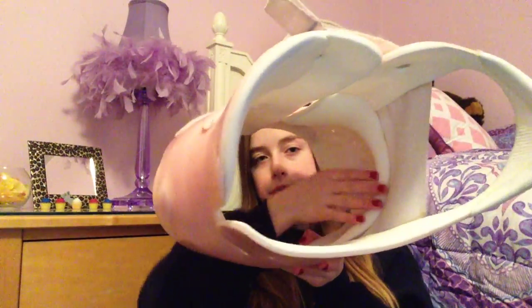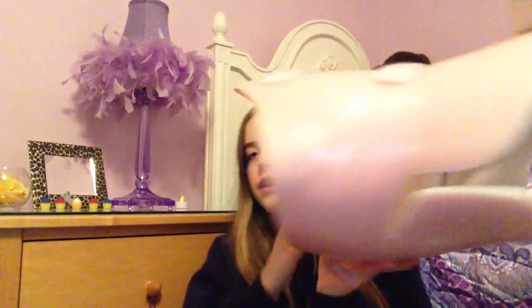We strap this one first, and then this one, then this one. And on the inside, there is just some padding — there is padding right here, right here, and right here. And the padding pushes on your spine to make it straighter.